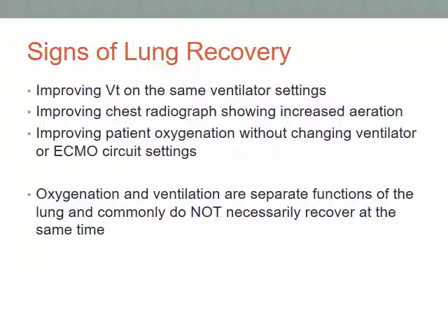Something we've noticed is that oxygenation and ventilation sometimes heal at different rates. We've had patients who get oxygen very, very easily, but you turn down their ECMO and they start breathing very fast, their ventilation goes through the roof, and their CO2 goes up. They can't exchange carbon dioxide, even though oxygen goes in and out fine, or vice versa. More often, we see oxygenation improve before ventilation. So the fact that oxygenation is improving doesn't mean that they're going to be off ECMO tomorrow, but they might be.